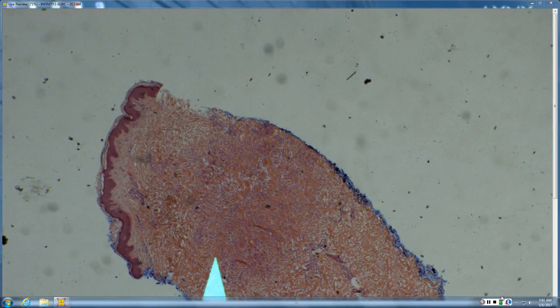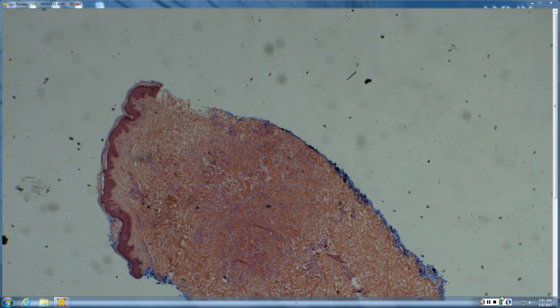Looking at this one, is it top to bottom, side to side, or is it focal and patchy? It's focal and patchy. And do you have any areas where the collagen has degenerated, with space between collagen bundles? Yes. And that probably represents GA. Yeah, mucin, so GA. So you correctly said, probably granulomatous, but certainly interstitial. You can always get a stain if there's a question.